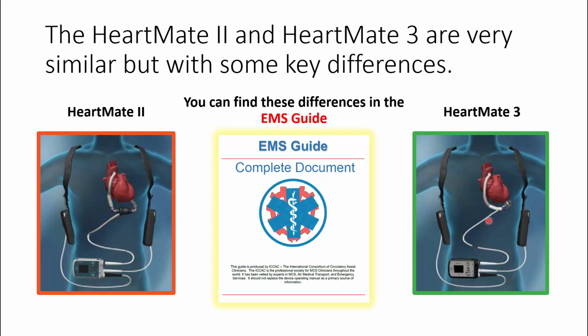They're from the same manufacturer. They look almost identical, as you can see here, but apparently there's some subtle changes in the software and the controller that you need to know. The HeartMate 3 is the next generation, by the way.